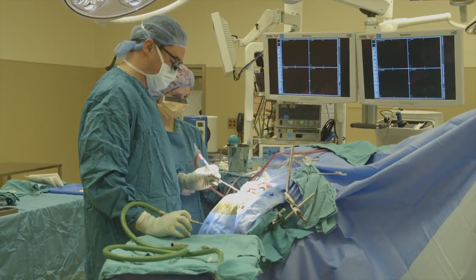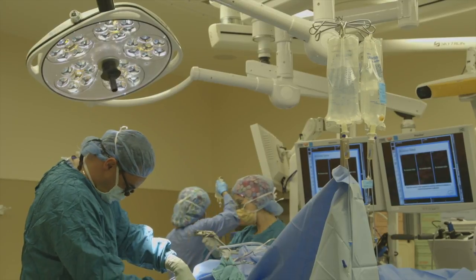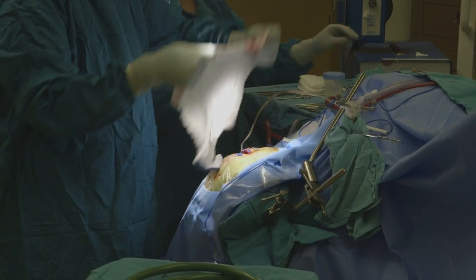To record the brain activity, it's got to go through the wrapper around the brain, the bone, the muscle, and the skin.